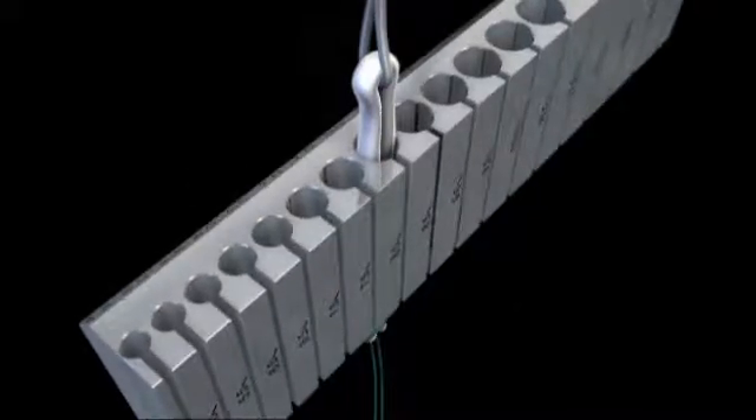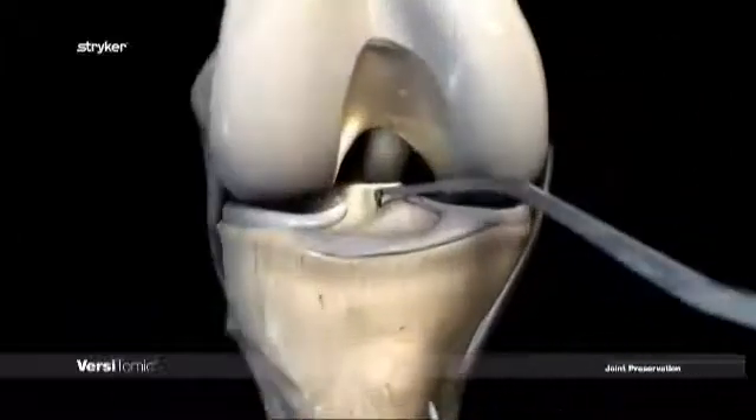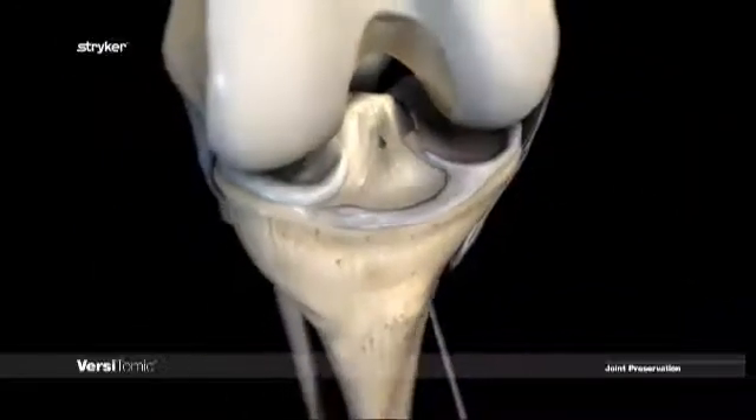Size the graft using the slotted sizing block. The tibial tunnel is created using standard techniques and can be done before or after the femoral tunnels are created.